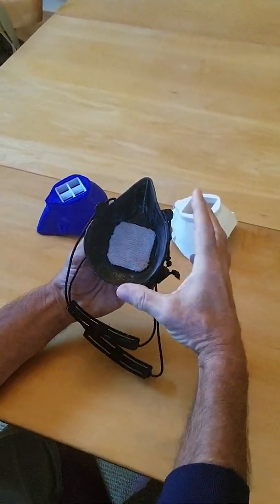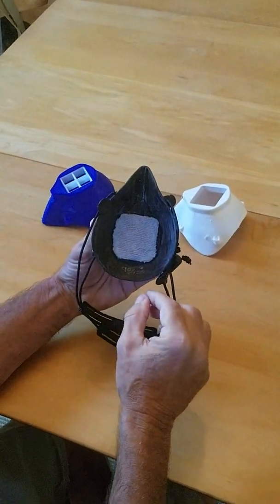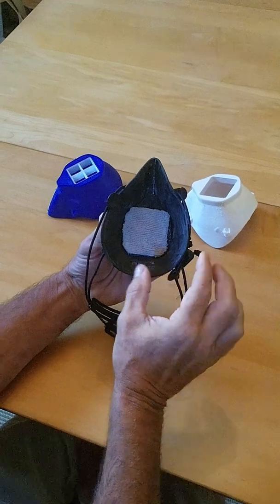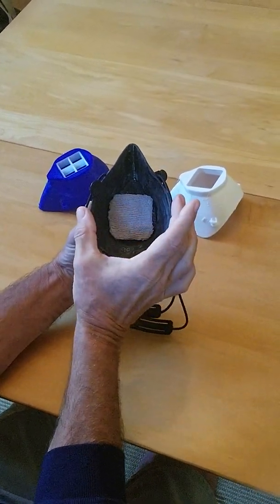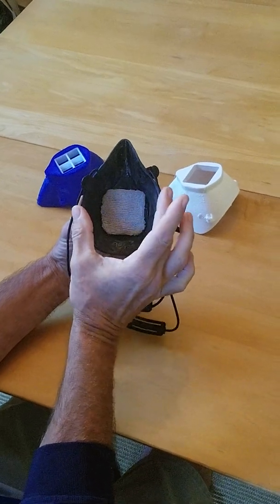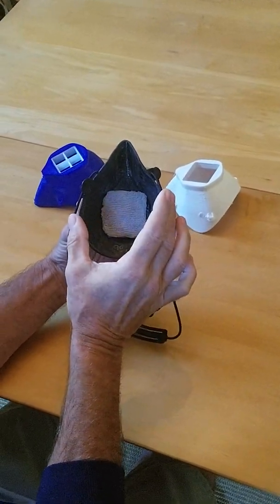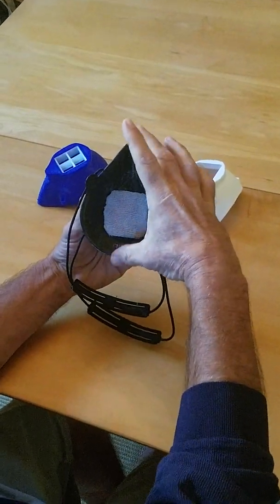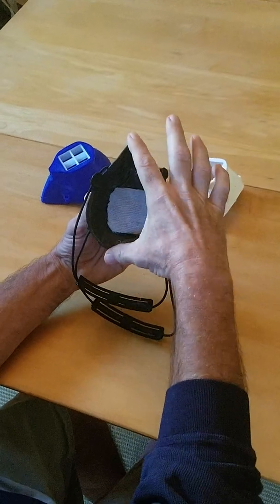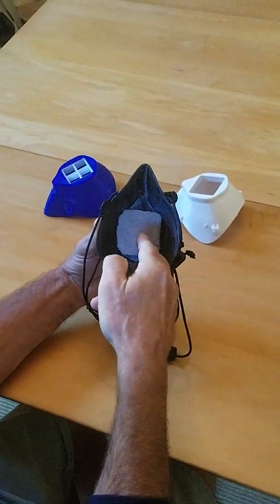So this mask right here is a 90, 95, 120. You don't have to memorize this, but just to let you know, it is 90% of the original design in the X or width size, 95% of the original height, and it's 120% deeper than the original.